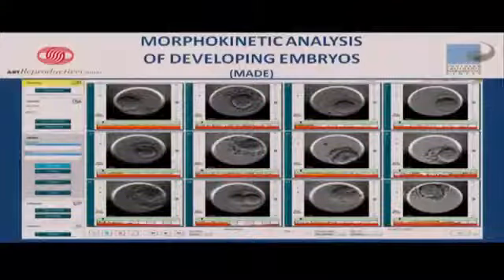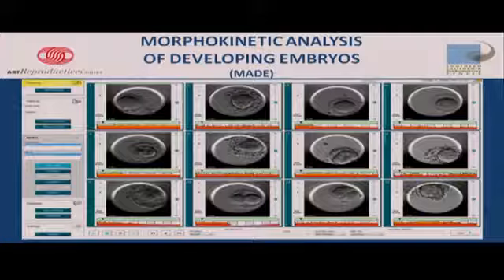look at the micro differences between one embryo and the next in order to rank them and ultimately give you the best choice of, we hope, one embryo at a time, in order to give the highest percentage chance of success with also the lowest percentage chance of having an abnormal pregnancy develop, because that only slows down a person's progress through fertility treatments, and leads to very difficult choices being made.